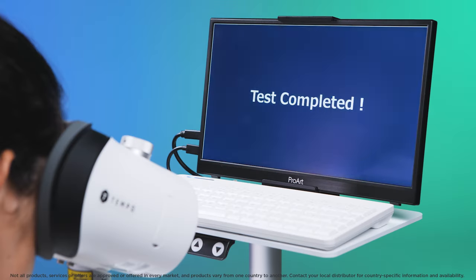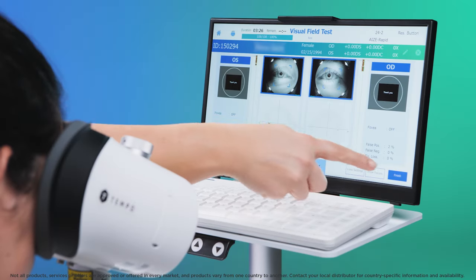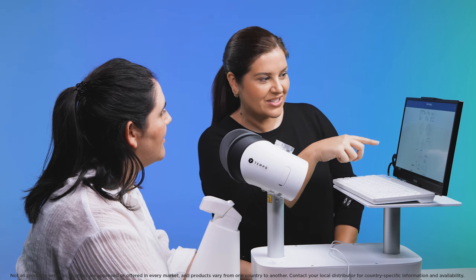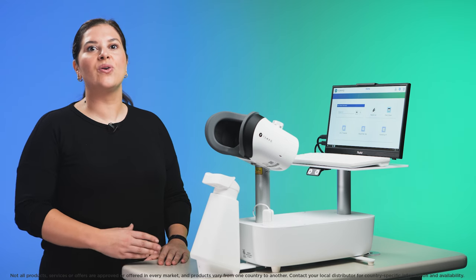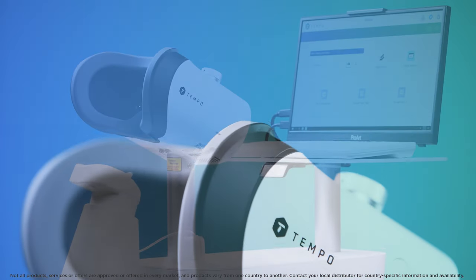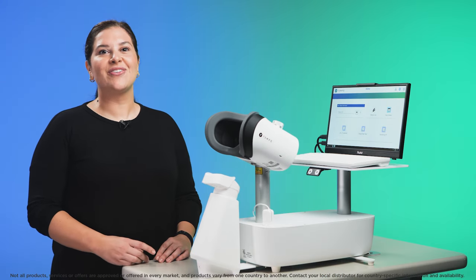Upon test completion, the words 'thank you' will flash up for the patient and the operator will see 'test is complete.' Click anywhere on the screen then select finish to return to the home screen. The results are automatically saved at the end of the test. The reports for each eye can be printed or automatically exported to Harmony or EHR. Since both eyes are tested simultaneously there is no need to repeat the test for the second eye — better for you and better for your patient. For more information please visit Topcon Healthcare University.